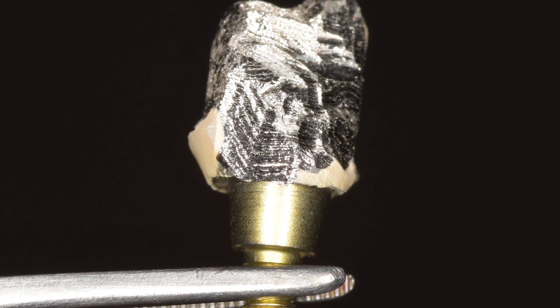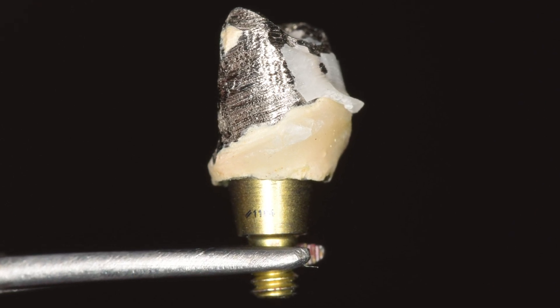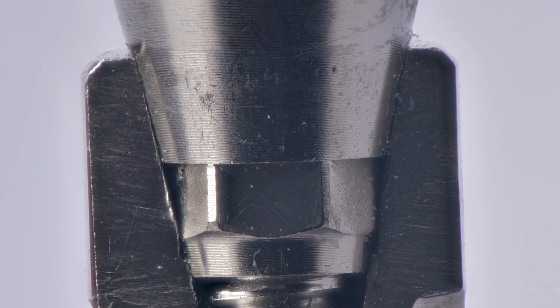There are situations when the abutment and screw are monolithic, and in this case it is necessary to remove the crown and use forceps or a suitable holding instrument to unscrew the abutment. Fortunately, most systems will have a classic abutment and screw.